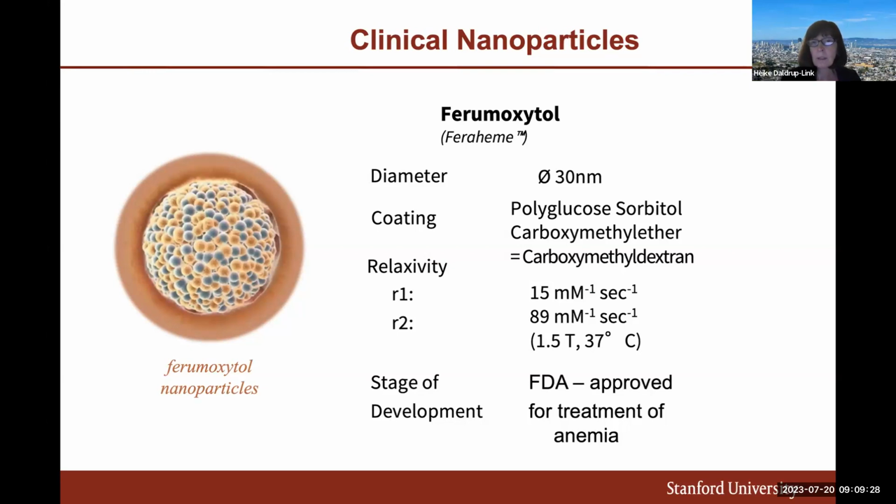And these nanoparticles are FDA approved for the treatment of anemia. They are not approved as a contrast agent. And so that means that for research applications, we need an IND to apply them. For clinical applications, some investigators use them off-label for certain applications, as I will show you in a second.